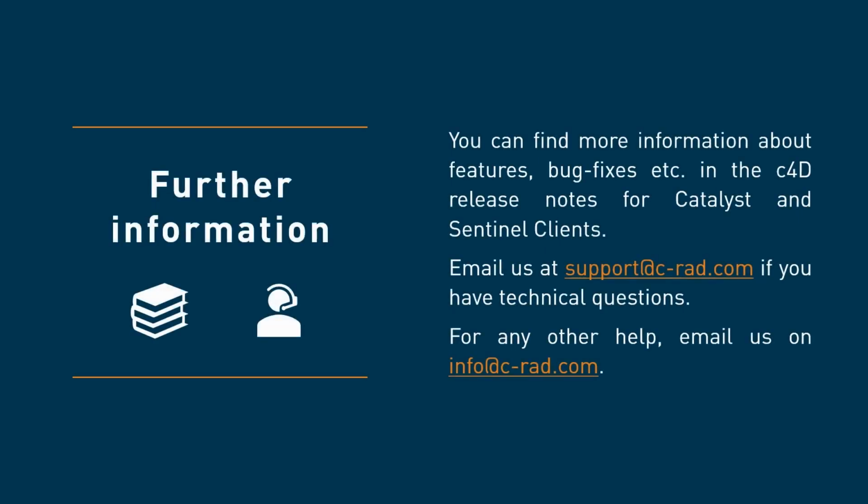Wonderful! This is it for the upgrade training to c4D 612 Service Pack 1 and 613 Service Pack 1. If you have additional questions or you want to have further information about the software releases, please check out the release notes for Catalyst and Sentinel. The upgrade instructions with the tests to be performed will also be sent to you and are included in the c4D file.